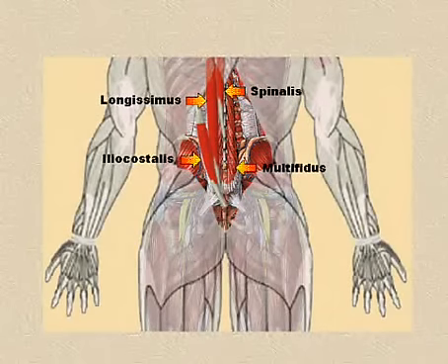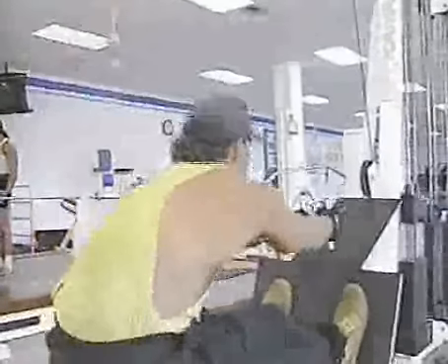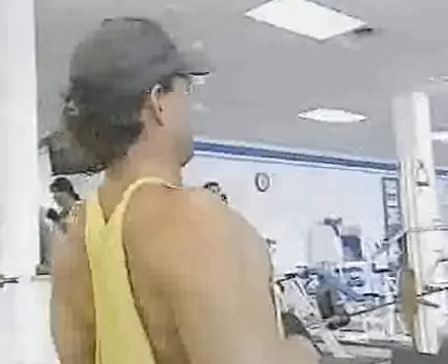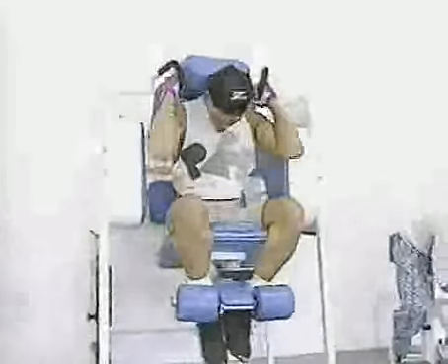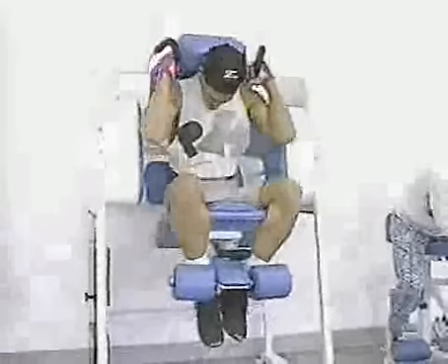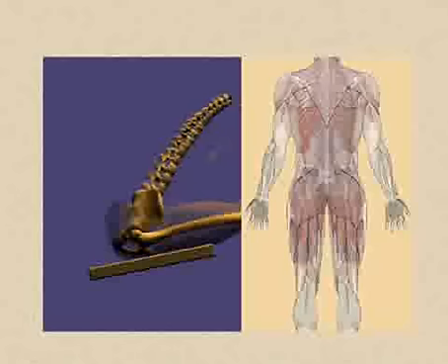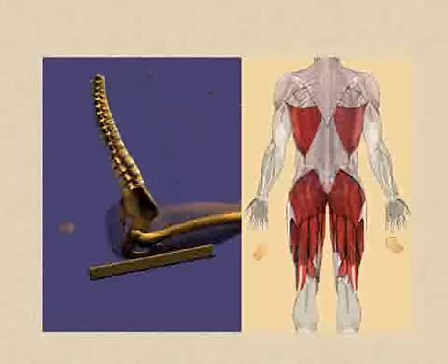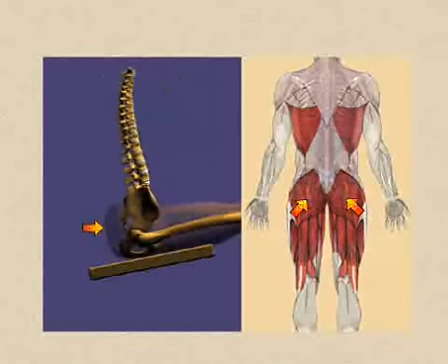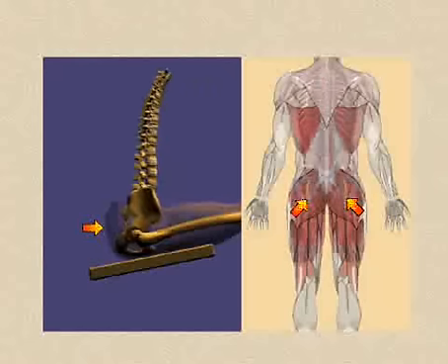Most subacute and chronic back pain sufferers have tried exercising their back muscles at their local gym, done sit-ups, and a variety of other things. While these activities do have some benefit, they do little, if anything, for strengthening the muscles of the lower back. As long as the pelvis is free to move during exercise, the larger hip and leg muscles perform the work, while the low back muscles remain weak and inactive.